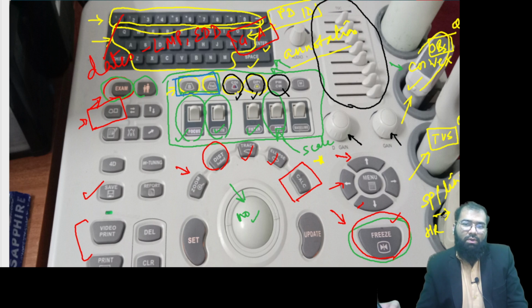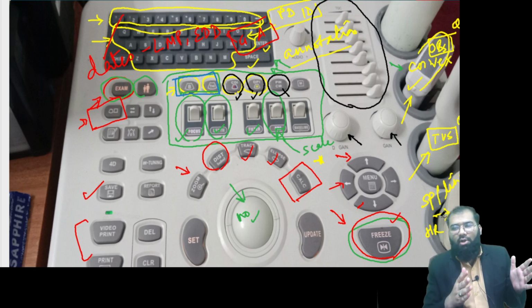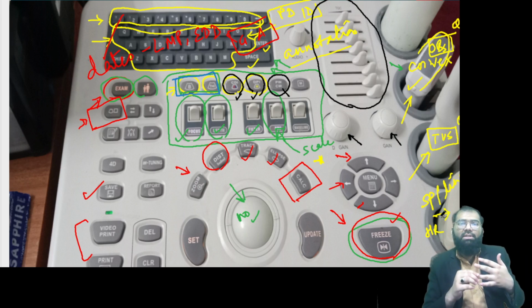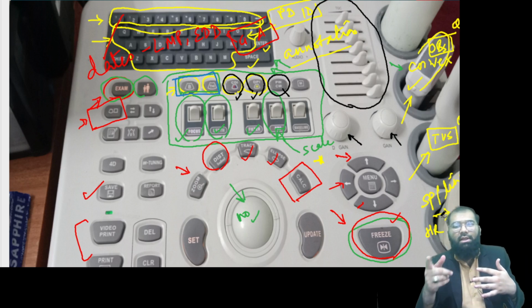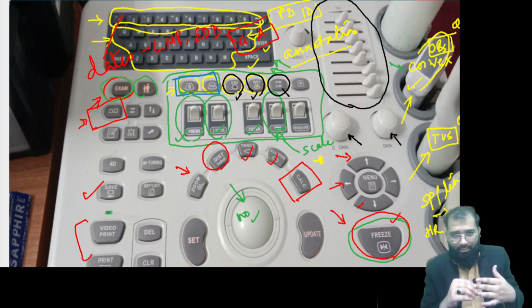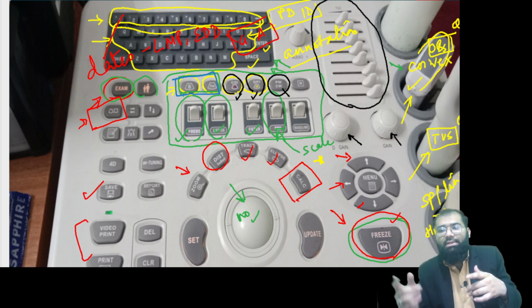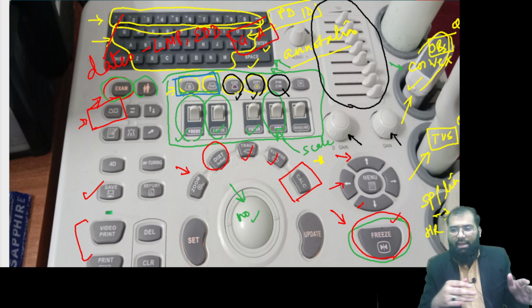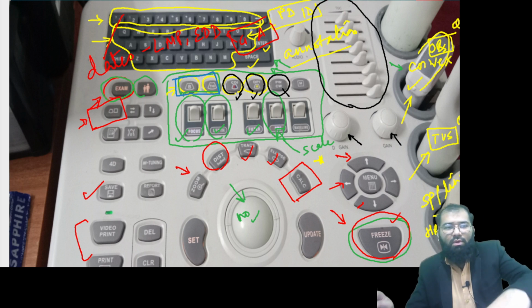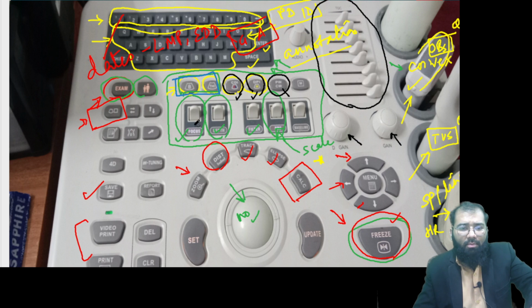Okay. So depending upon that, suppose you have got an abdominal scan. Which probe will you prefer, the abdominal or the convex probe? Suppose you want to examine for OBS first trimester, again you select the convex probe. You want to do OBS Doppler, convex probe. Suppose you want to do the scan in early pregnancy, you will take transvaginal scan. Again, linear probe, when you want to look for superficial structures.